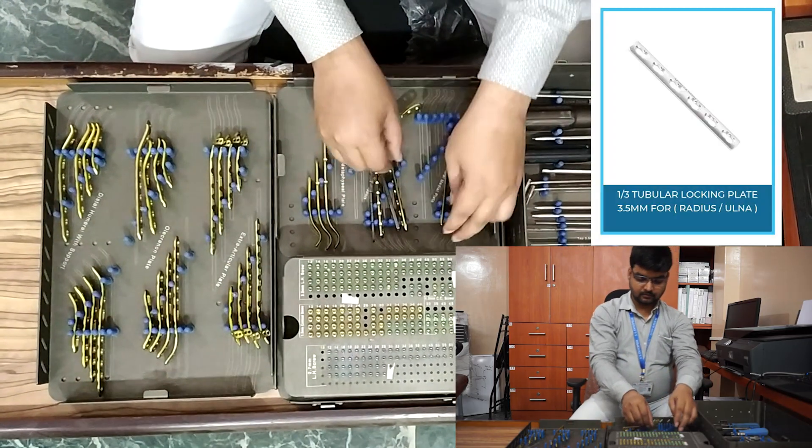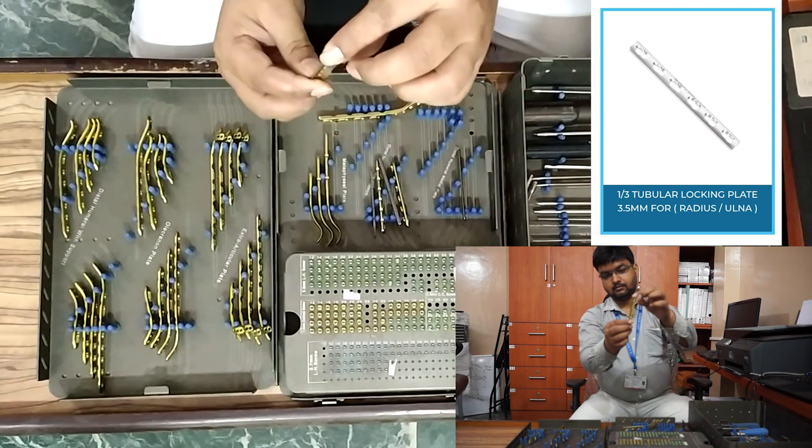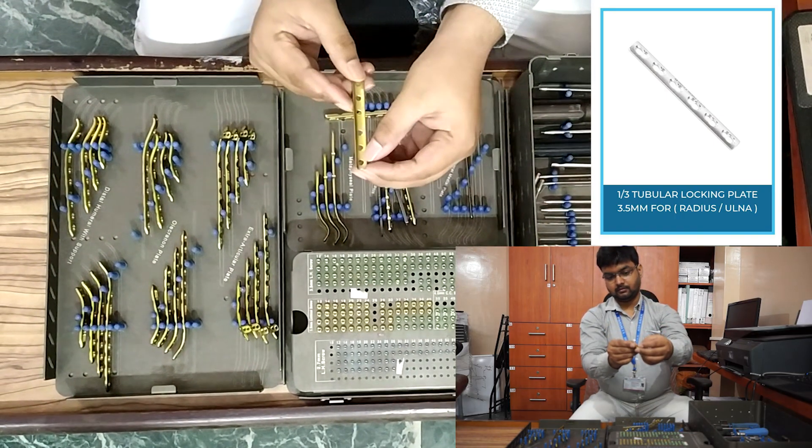One-third tubular non-locking plate: five-hole, six-hole, seven-hole, eight-hole, nine-hole, and ten-hole.